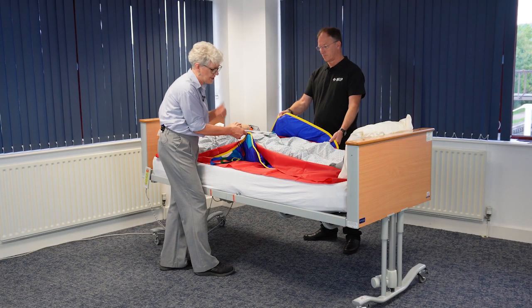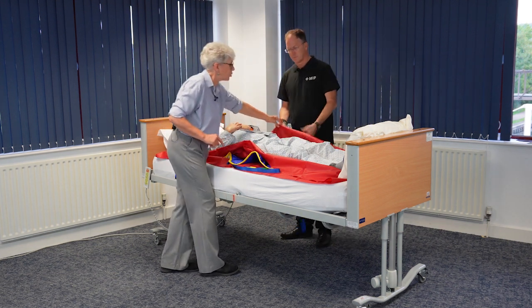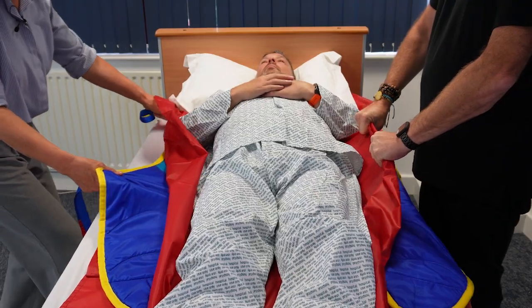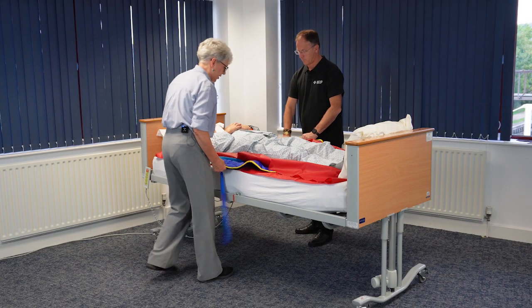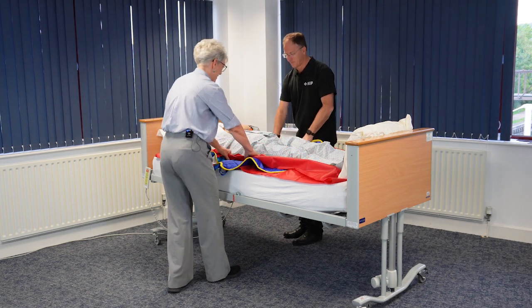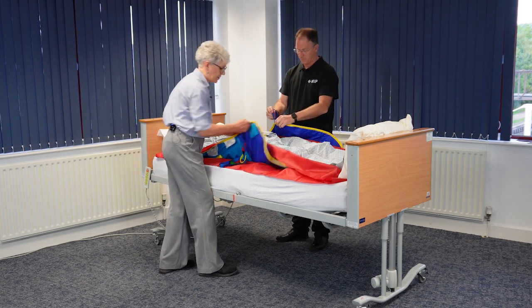I need to bring the sling through a little bit further. To do that, Chris is going to hold the top layer of the slide sheet and I'm going to gently bring the sling through. Just sliding it through — very easy to do — just to make sure that it's central. I think I might have overshot, so we're going to go back a little bit. Just a tiny bit — it's very easy to reposition.